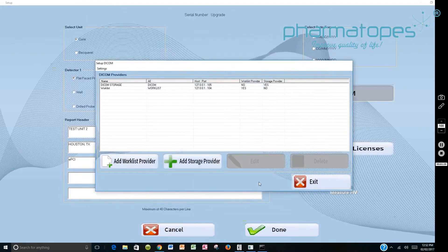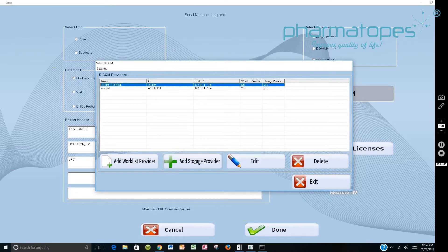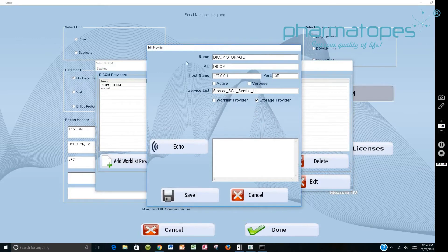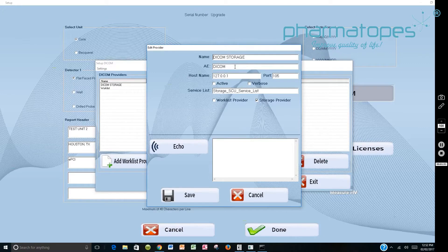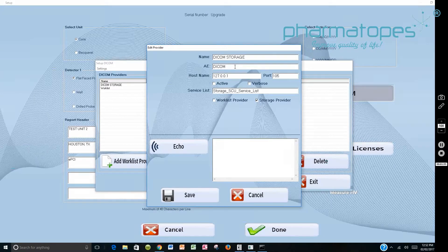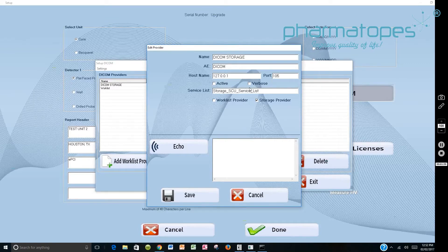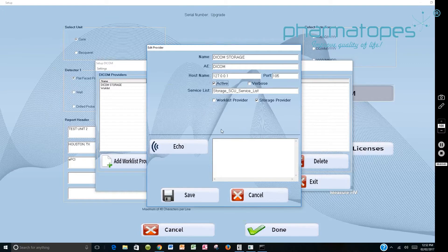Then you want to do the same for the DICOM. You would say Add Storage Provider, and then DICOM brings up this page. You would fill out the name. In my case I call it DICOM Storage. The AE title, whatever AE title is provided to you by the PACS Administrator, the IP address, and the port number. I usually say Active here, and this information is filled in automatically.